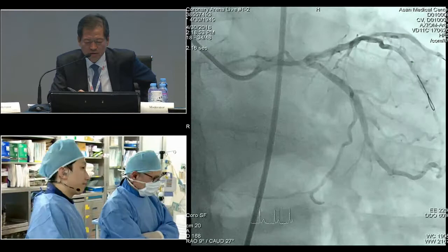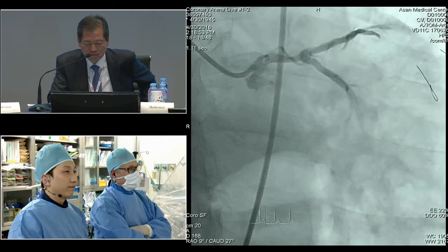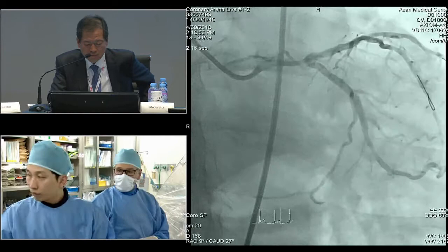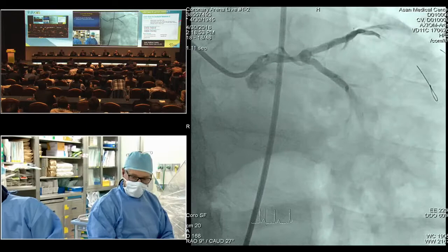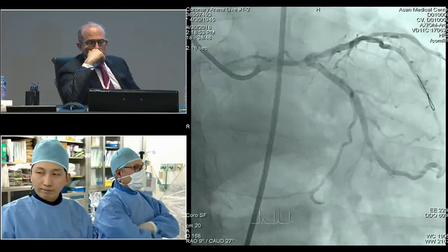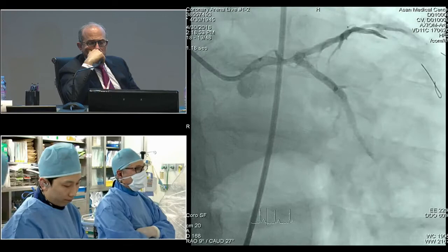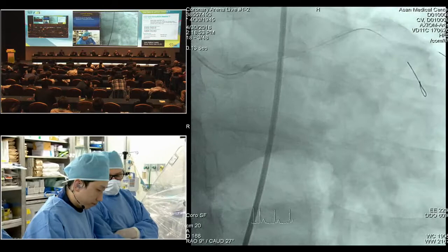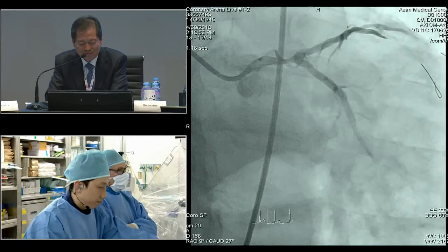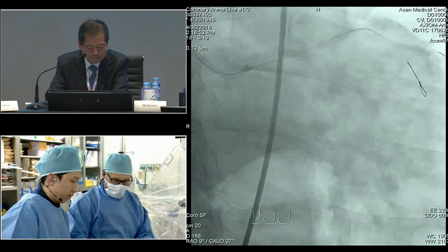Dr. Rapp, have you checked the distal left main by IVUS? No, but FFR was 0.66. So there is no doubt that we should treat it. Have you given any thought to atherectomy in the distal left main? No. It's moderately calcified, so I think it's not necessary to use a rotablator in this kind of case. I think the FFR is significant, and I agree with you that the left main disease is significant, but with the IVUS, we can find the actual size of the vessel and select the right size. What do you think? How do you measure the size with the IVUS or OCT? Media to media?